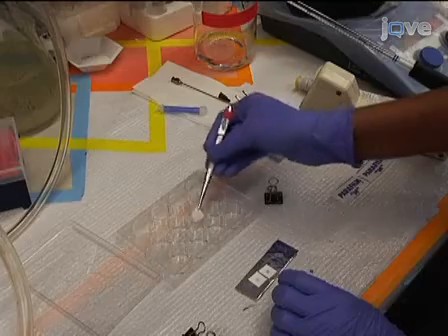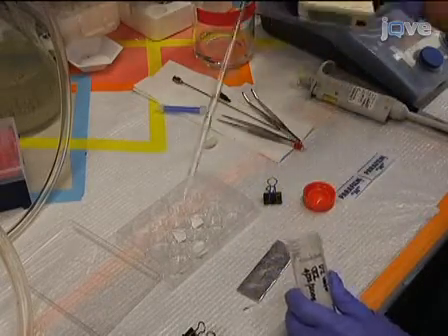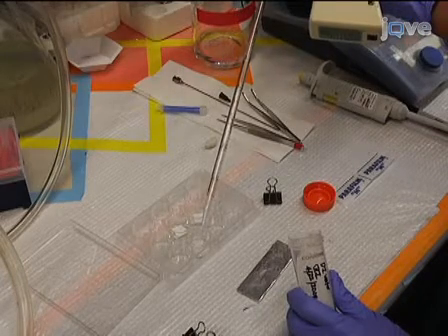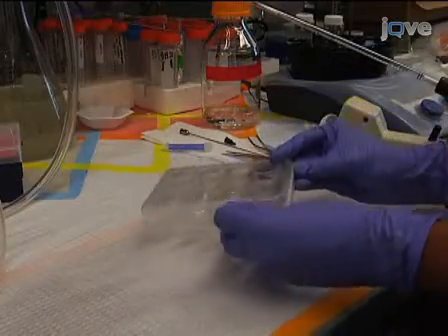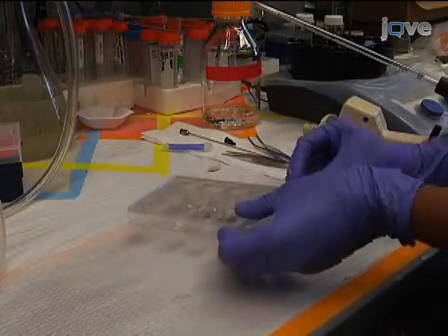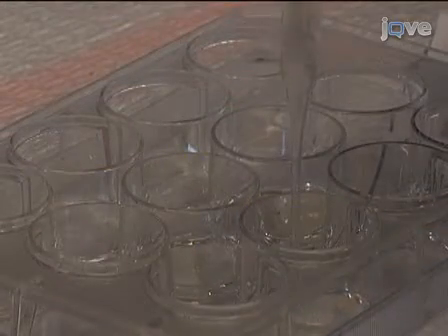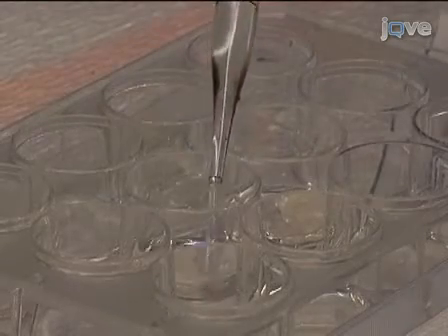Remove each scaffold and place in a 12-well tissue culture plate. Add 2 mL of deionized water into each well. Parafilm the plate to prevent evaporation of the water, and place at 37 degrees Celsius for 24 hours. Change the water every 8 hours using a vacuum pipette to aspirate deionized water from the well between washes.